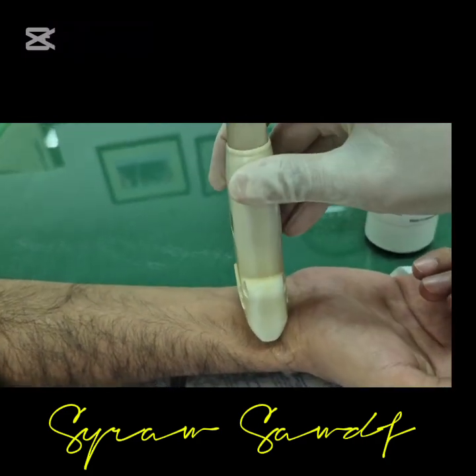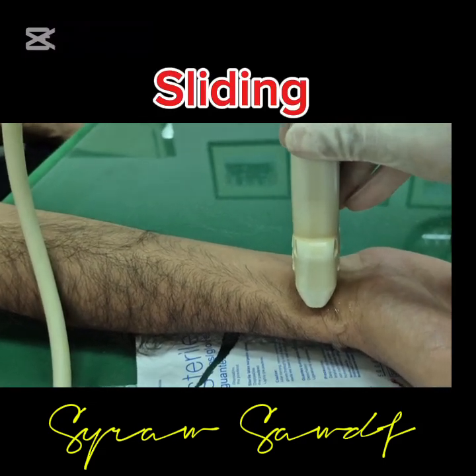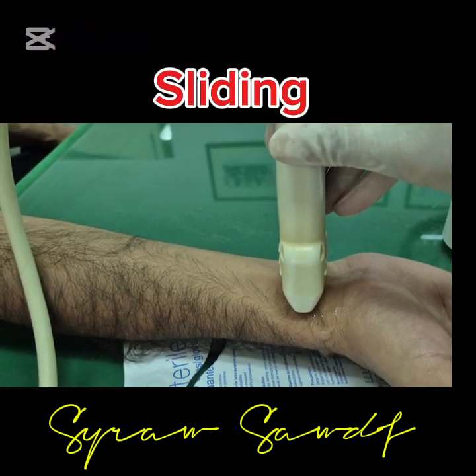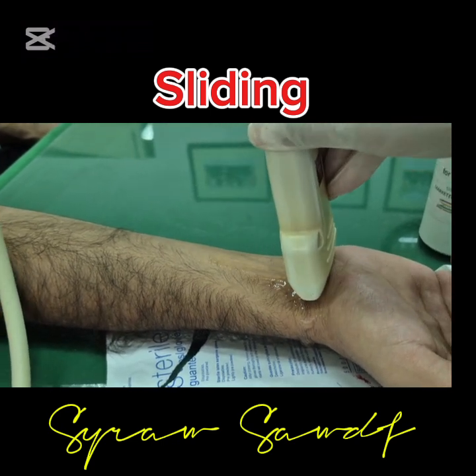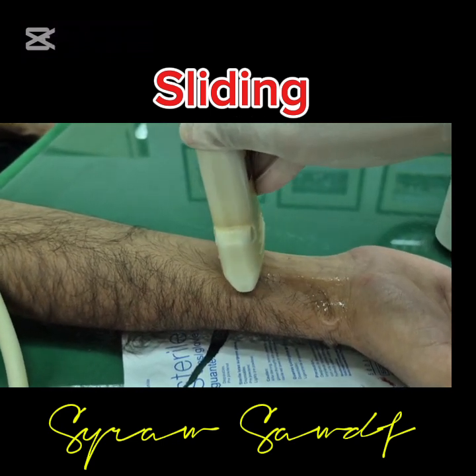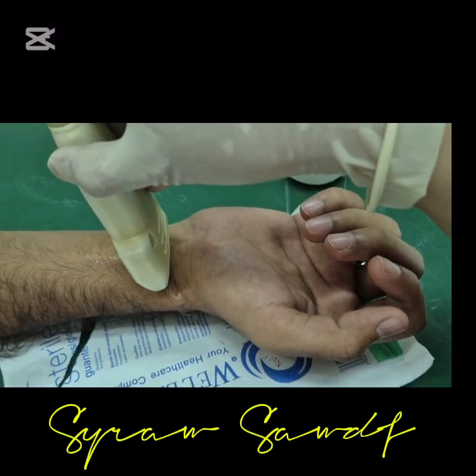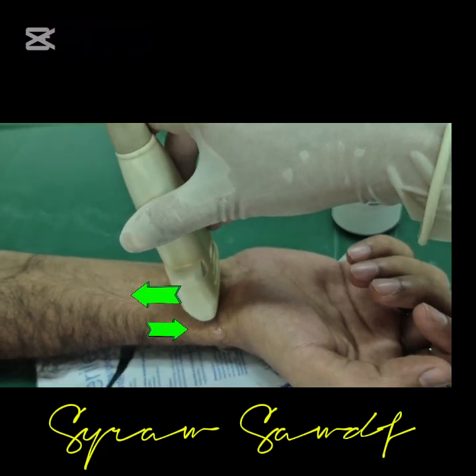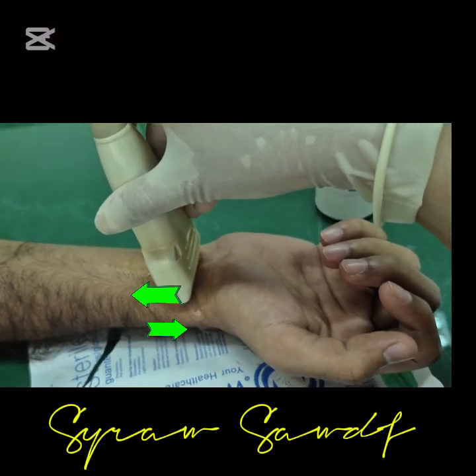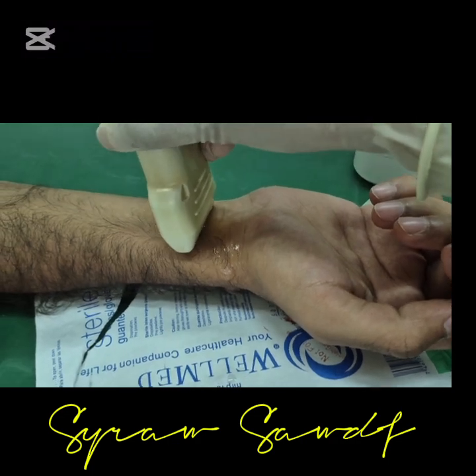So now this movement of the probe is known as sliding. Simply, I am sliding. By sliding, what will you get? Let me show you. I will keep sliding my probe back and forth, and you will see the change of the image. The whole image will be changed on the screen by sliding it like this.